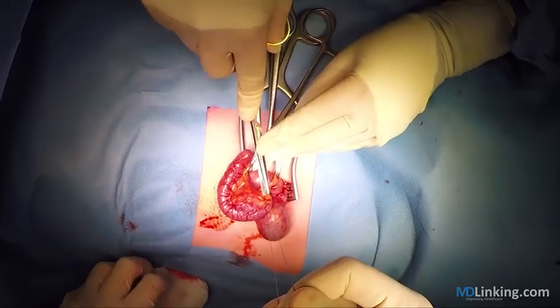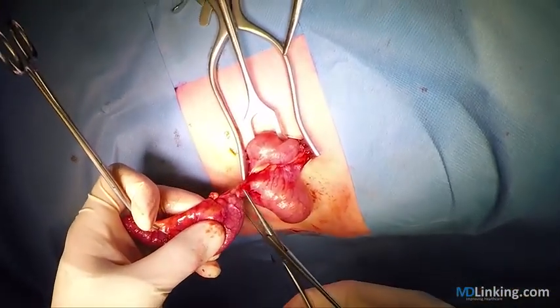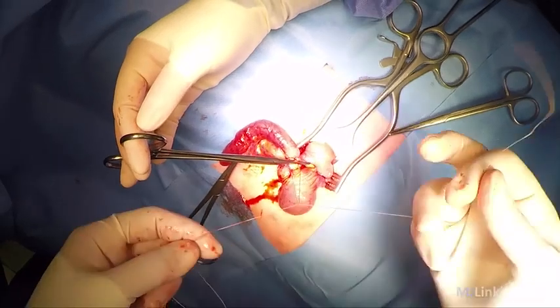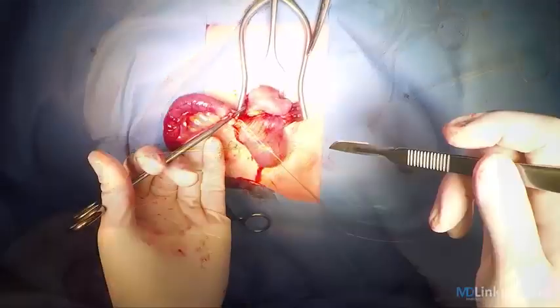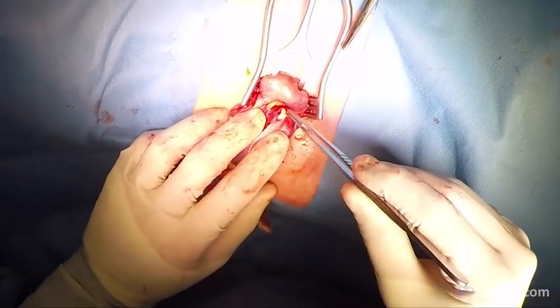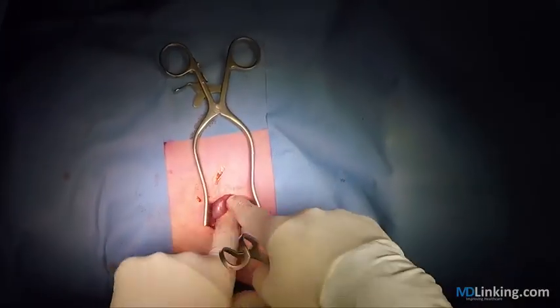So once we're done with the ligation of the artery, we can crush the base of the appendix, place the clamp just distal from the crushed area, and place our ligature around it. And then you can cut the appendix just below the clamp and remove it. Make sure that your ligation is properly secured, and we then reposition the cecum back into the abdominal cavity.